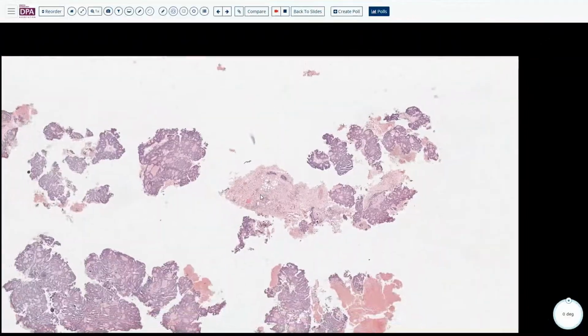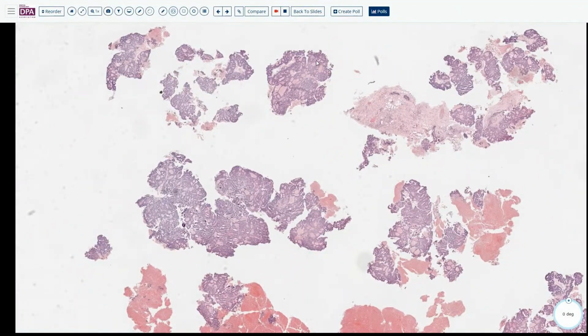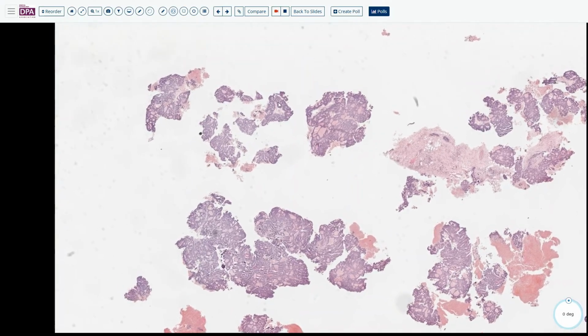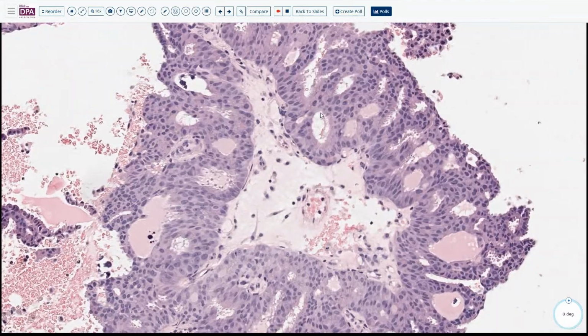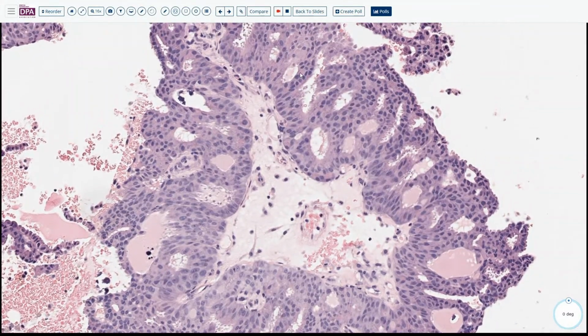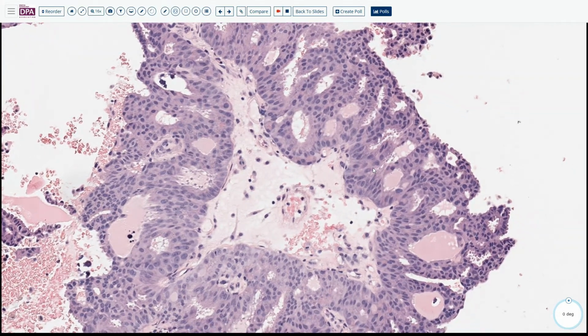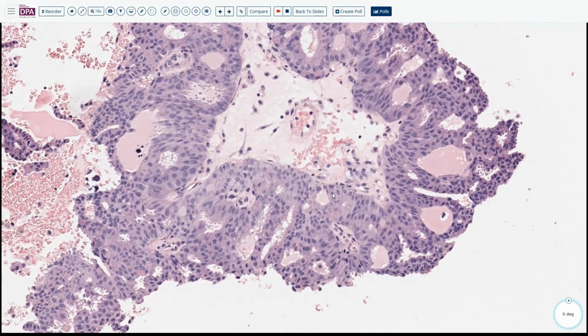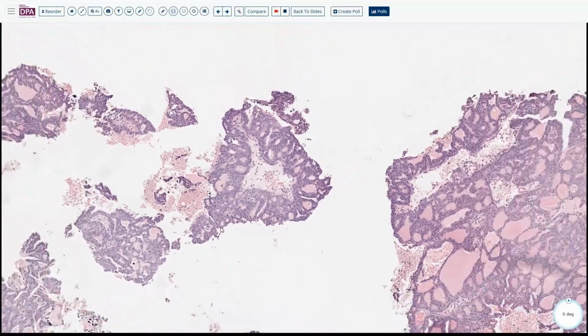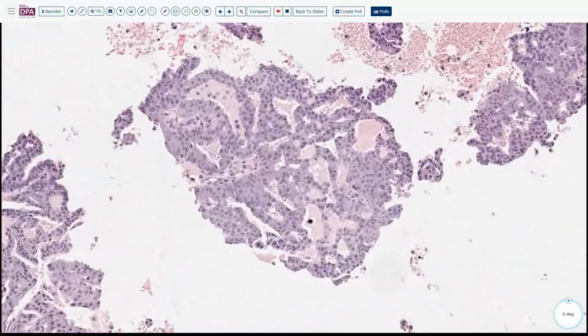But for this one, we have the architectural atypia. We can see they are forming fusing glands, forming this cribriform architecture. And when we zoom in, the cell is low grade, but they're forming these rigid lumens, and they polarize around the lumen. So clearly not, and all the cells do not really overlap each other. They respect each other, with distinct cell borders. This is also another feature of low grade DCIS.